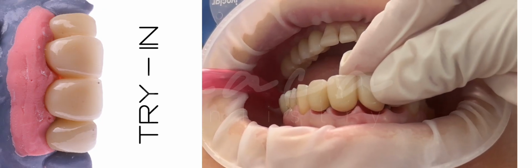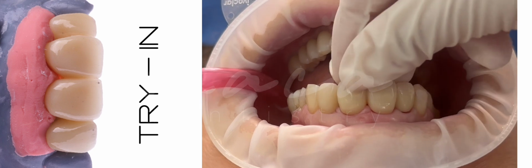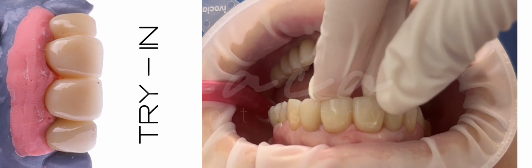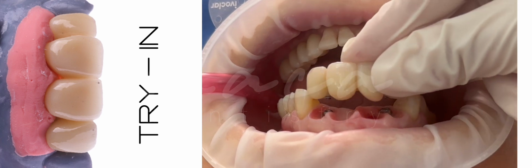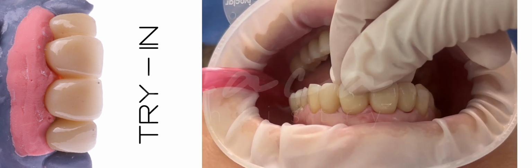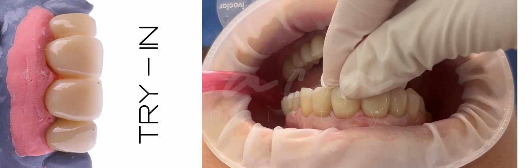Now in this video I'm doing the try-in of the anterior bridge over the OMNI abutments. We can see how the gum looks very natural, and also how the crowns adapt very well to the soft tissues, producing, in our opinion, a very beautiful and natural result.